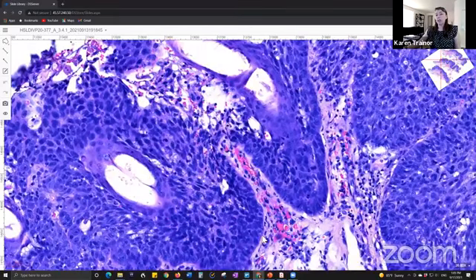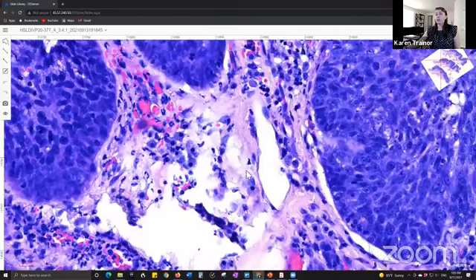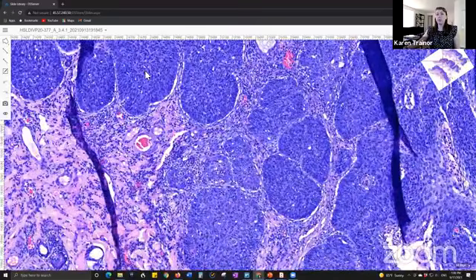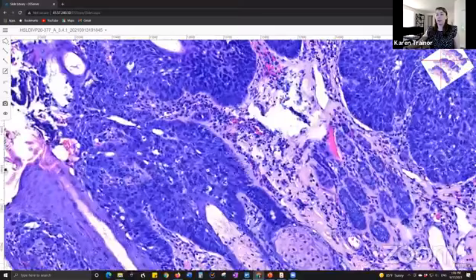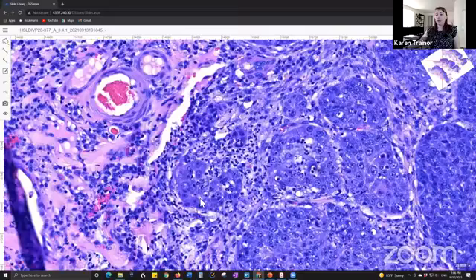But as we're cruising along, we see that these neoplastic cells, some people refer to this as respecting the basement membrane. We can identify that basement membrane, and it's intact. There is certainly inflammation here in the dermis. We have a mix of mast cells, we have some neutrophils, a hodgepodge, but we can start to see it's getting very expansive now as we move towards the center of the mass. As we go even further, you can see it becomes infiltrative. We no longer have that clear, well-demarcated basement membrane delineation like we did earlier on, more at the margins of the lesion. As we progress towards the center, you can see it's lost that barrier and has now invaded into the dermis.